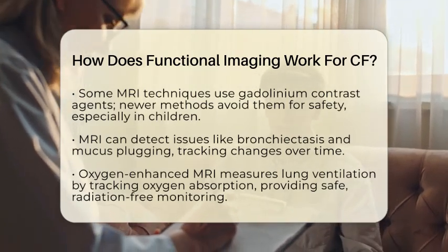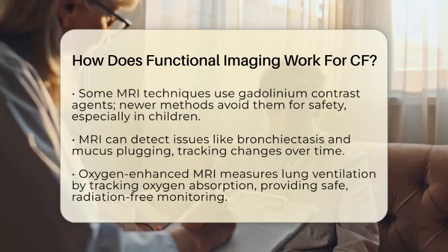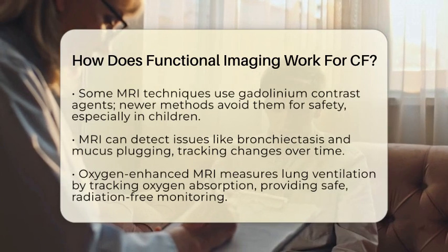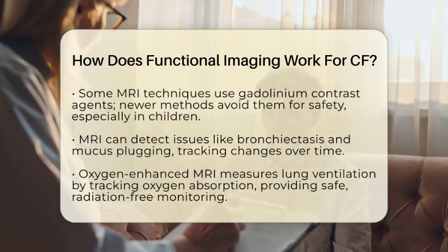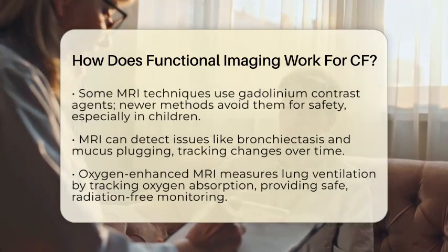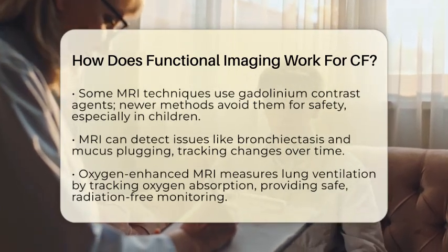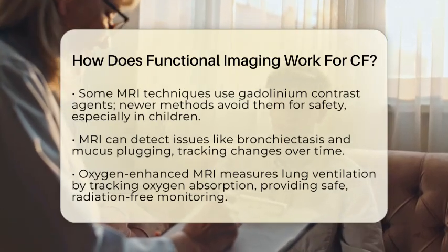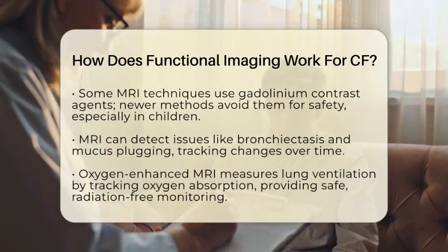Another exciting development is oxygen-enhanced MRI. This method measures how well the lungs ventilate by tracking oxygen absorption. It provides a quantitative view of lung function without exposing patients to radiation. This is especially useful for ongoing monitoring, giving a safe way to assess improvements or declines in lung health.